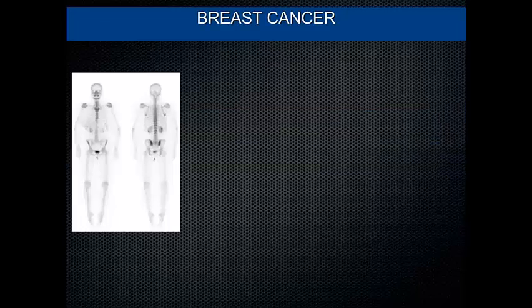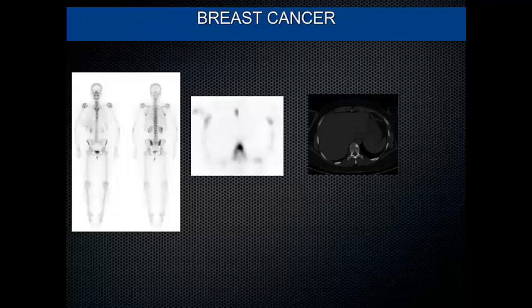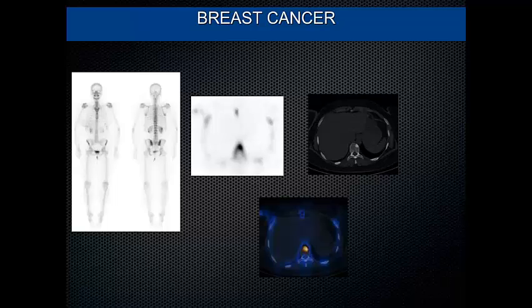This is again a patient with breast cancer, subtle patchy uptake in the spine. The question was whether the patient's got metastasis or not. With planar imaging, I could have erred towards suspicious, or I would have said inconclusive, further imaging, or I would have said just benign disease based on the level of experience and level of confidence. But with the combination, there is sclerosis, increased uptake, definitive metastasis. Therefore, you give a definitive answer to the clinician.